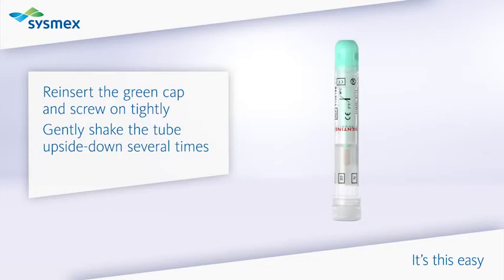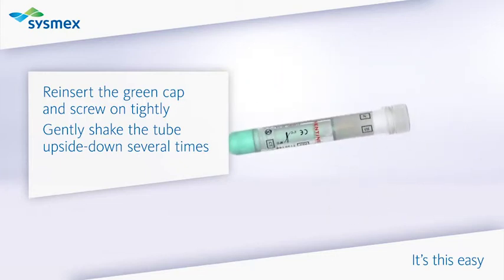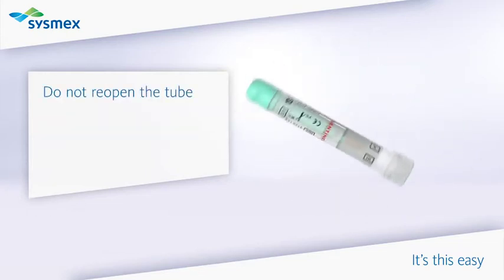Reinsert the green cap and screw on tightly. Gently shake the tube upside down several times. Do not reopen the tube.